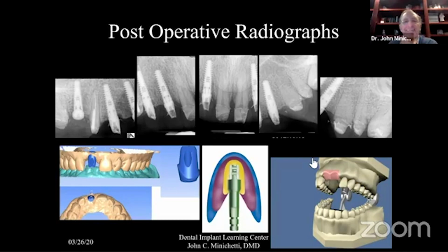So number one, the provisionals I used were the same provisionals. I would certainly get another set of provisionals, but I got these first provisionals to open up the occlusion without any surgery. Then I did the crown lengthening and relined the provisionals. If you notice, they were laid out. I kind of measured it, so they were overlapping till I went to reline. It was done before, trying to save some expense without 16 sets of provisionals here. And then I did reline the provisionals onto the implant.